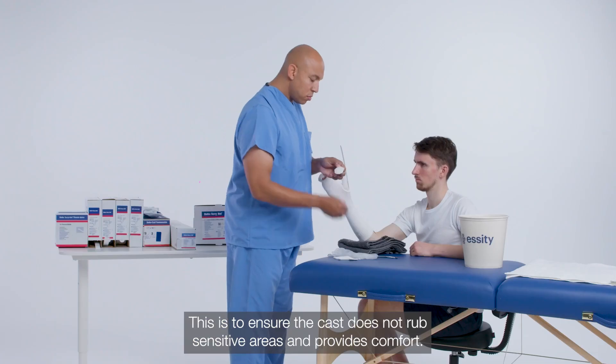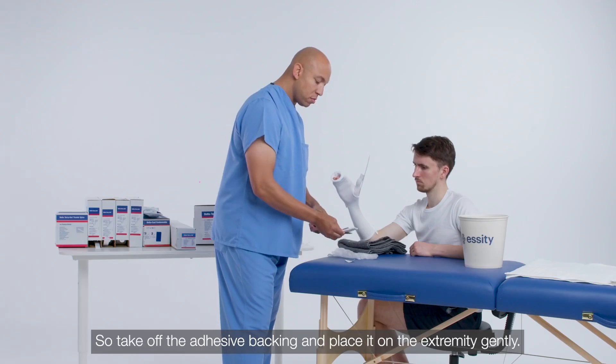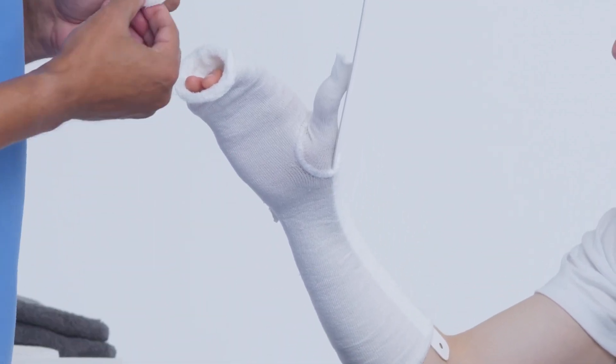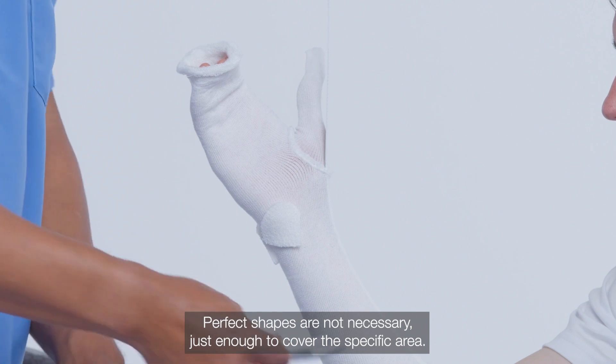This is to ensure the cast does not rub sensitive areas and provides comfort. Take off the adhesive backing and place it on the extremity gently. Perfect shapes are not necessary, just enough to cover the specific area.